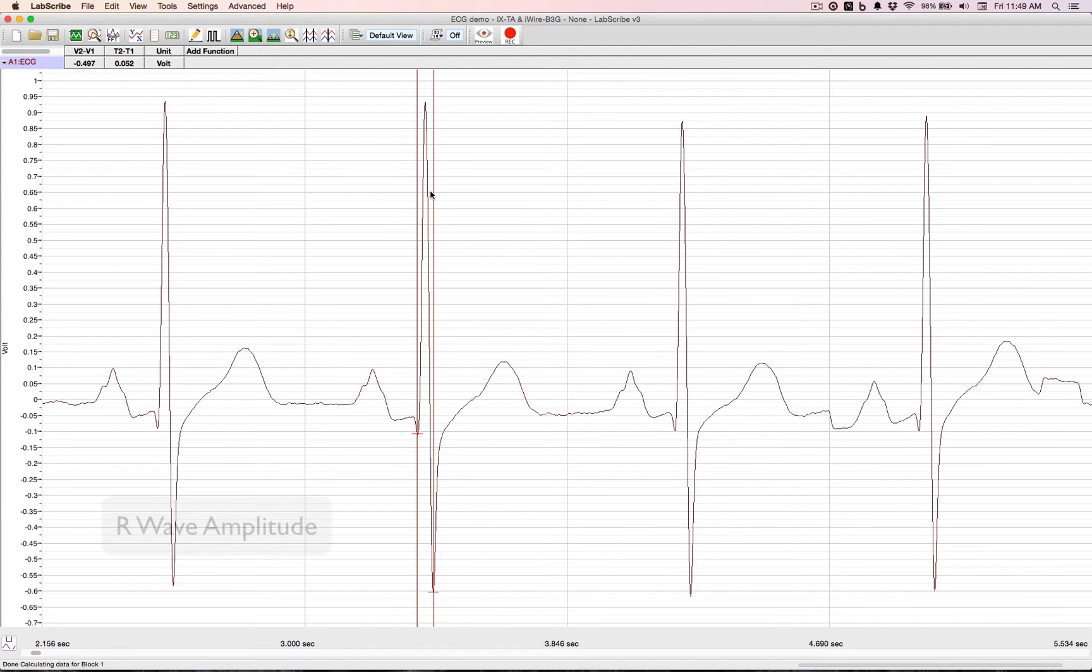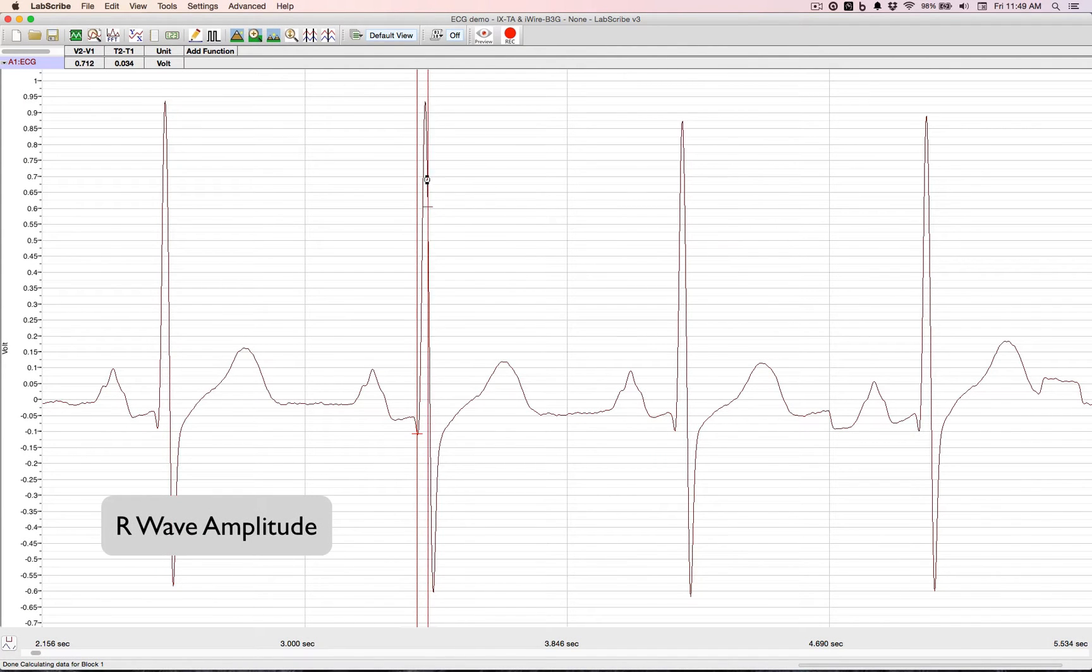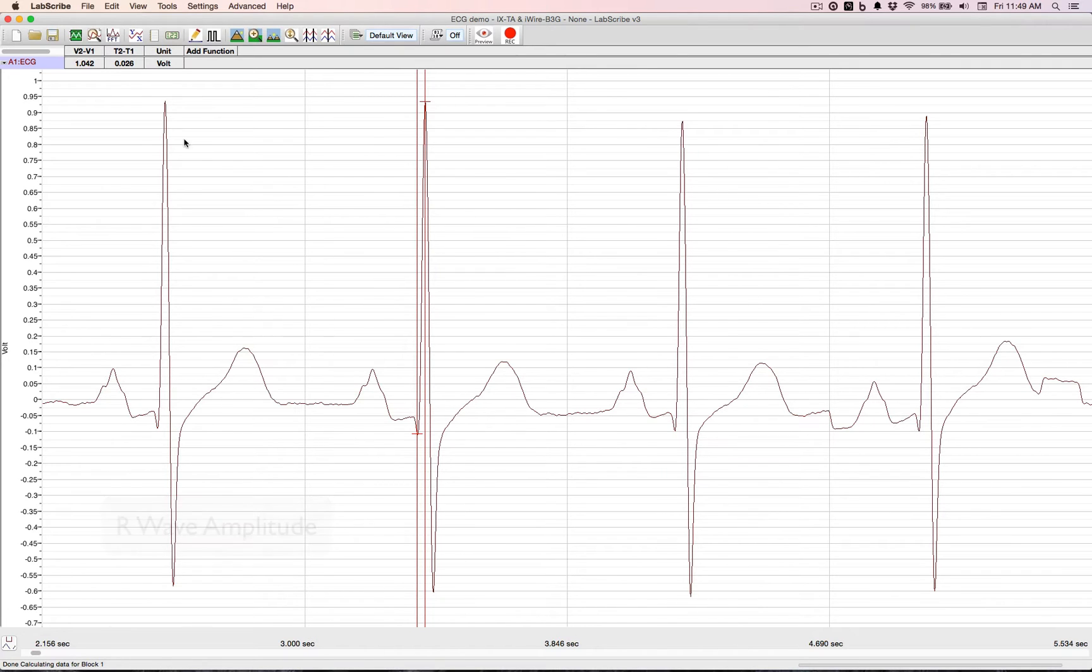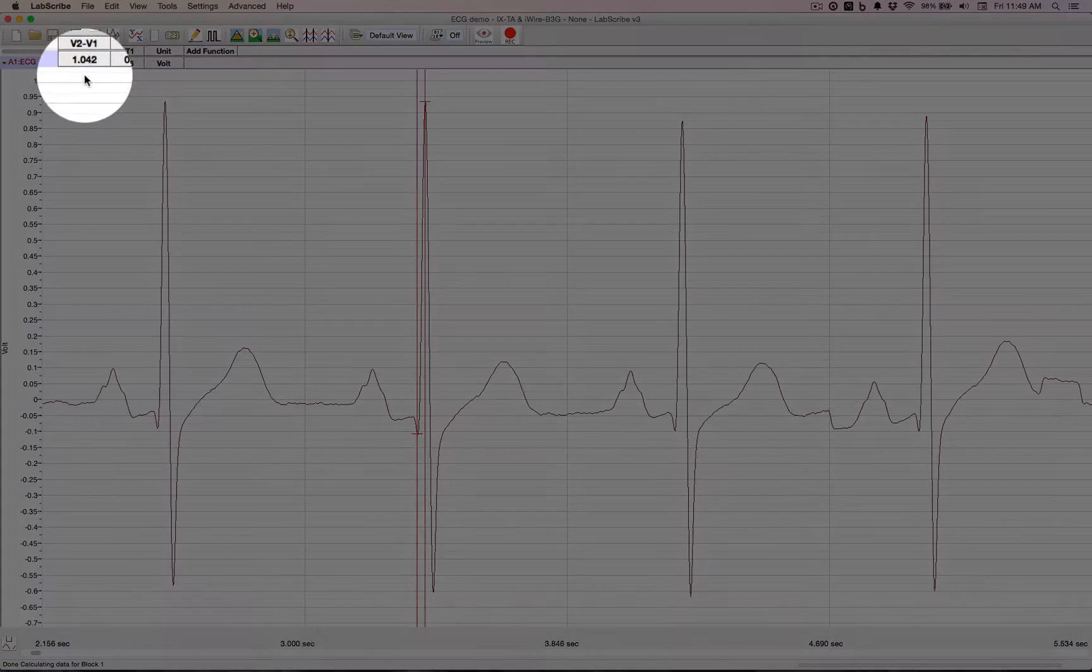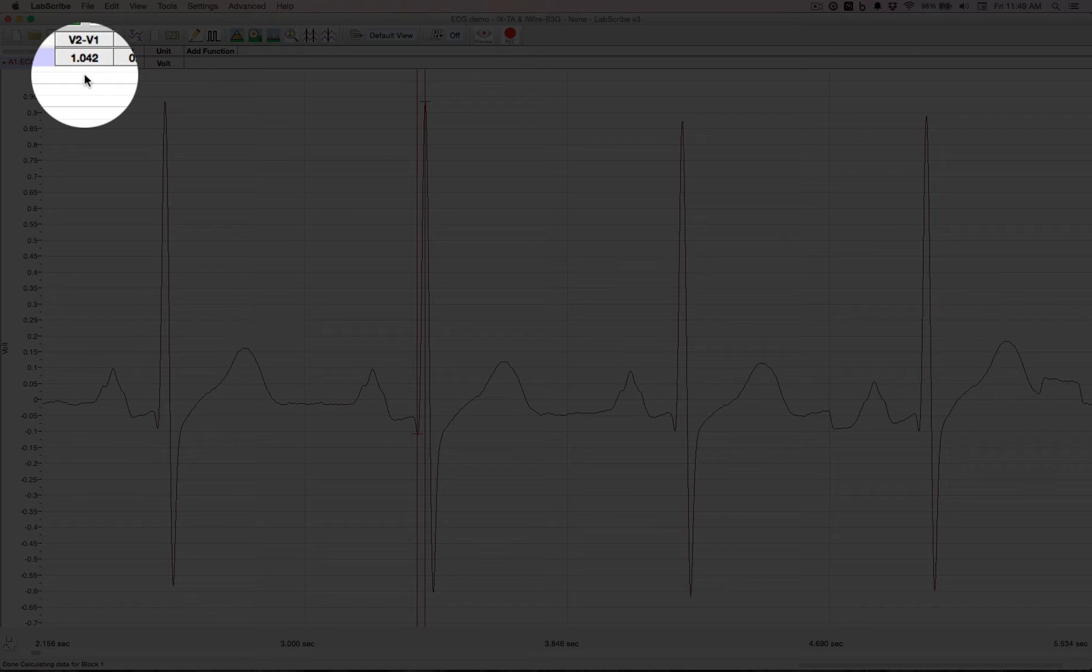Moving the cursor back over to the R, we can do an R wave amplitude. That's 1.042 volts.